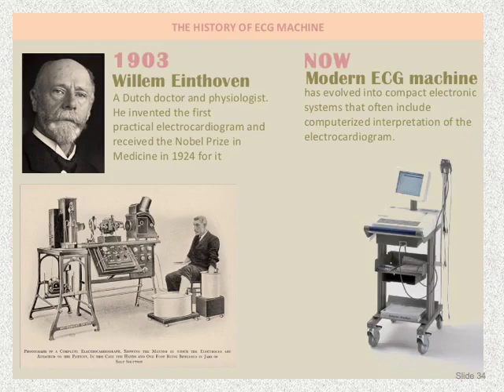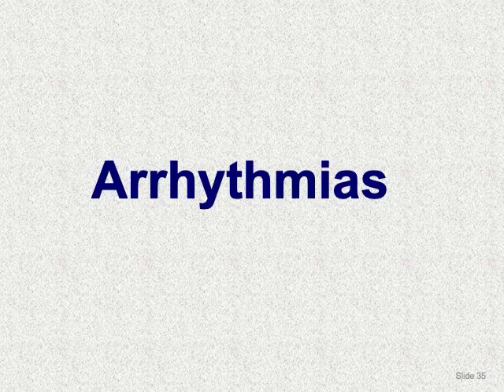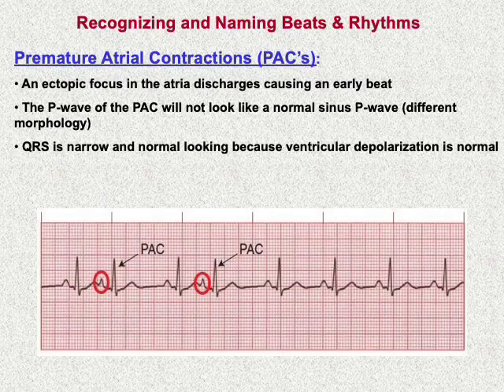And this will bring us to the second subject of our lecture, which is arrhythmias. Arrhythmias are the disturbance of cardiac rhythm. There are different types of arrhythmias. We will have a brief resume of these types.